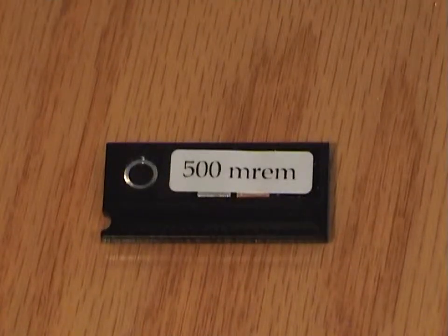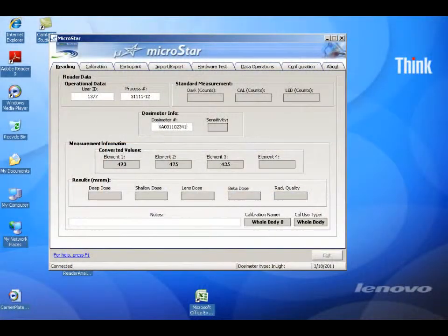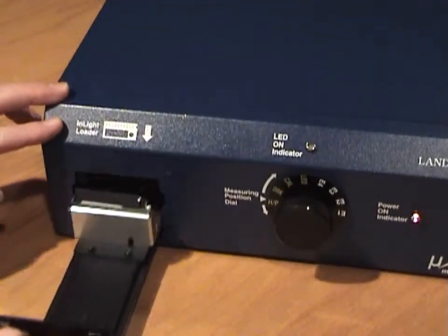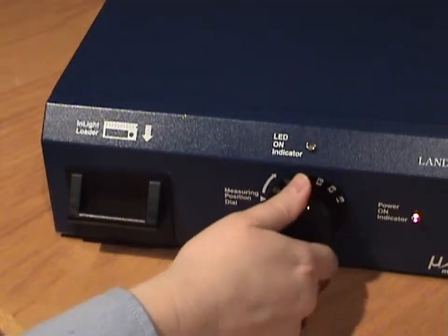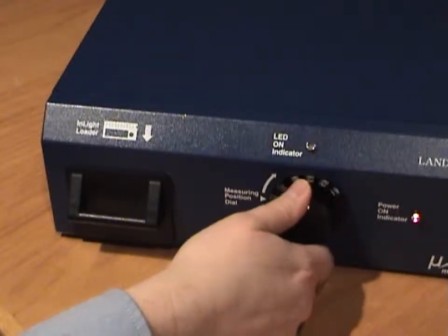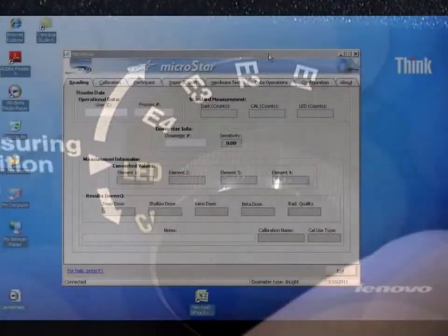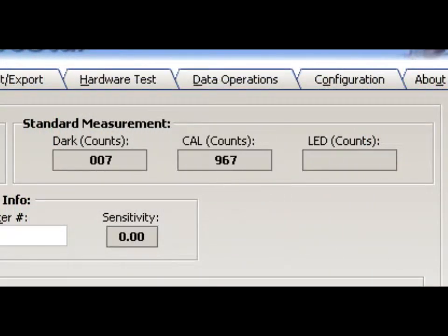Landauer recommends that before reading user dosimeters, you should first read QC dosimeters, which are dosimeters that have been exposed to a known dose, usually 500 mrem. You should also run the reader's standard measurements. To do this, remove any dosimeter that may be in the drawer nest. Close the drawer, then turn the knob counter-clockwise to the dark position. When the LED indicator turns off, turn the knob to the cal position, then to the LED position. The measurement values will be displayed on the reader software and should be compared to previous measurements to ensure the reader is functioning normally.